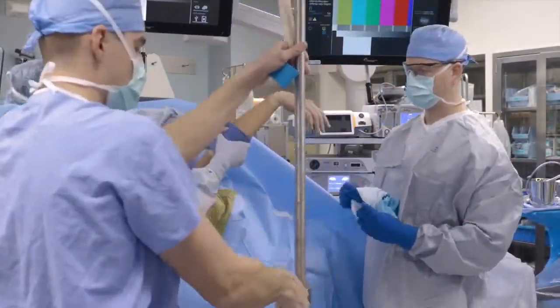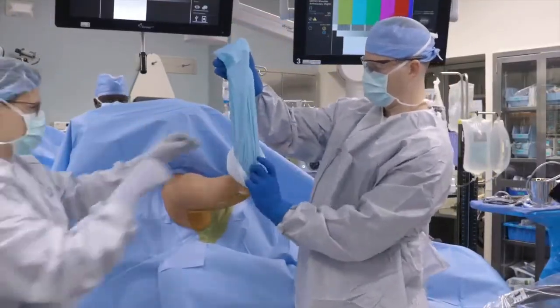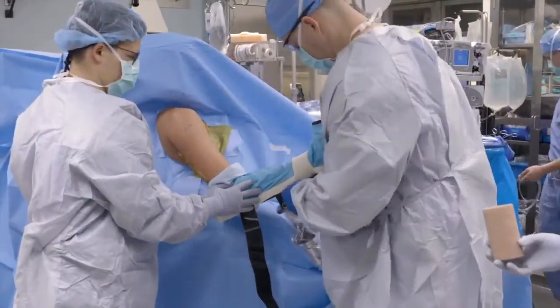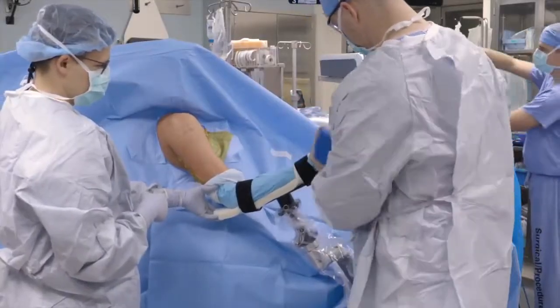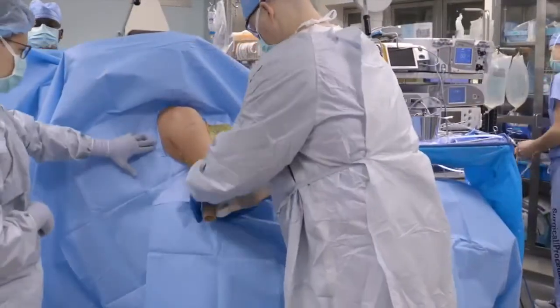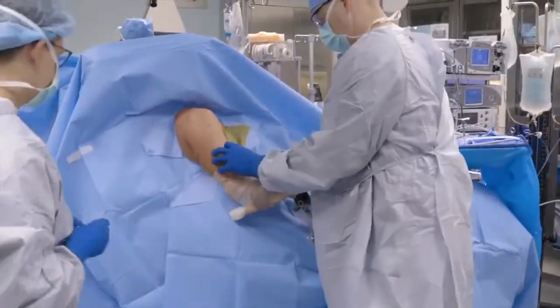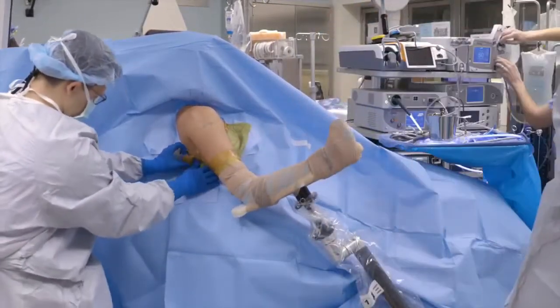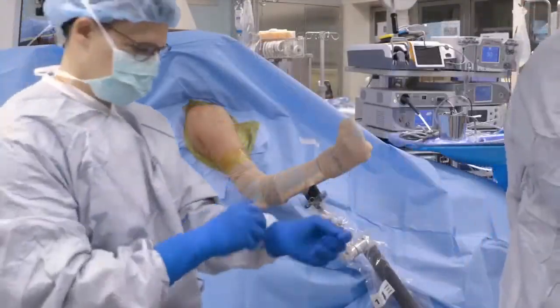The arm is then taken down after briefly being suspended, and an impervious stockinette is placed over the hand, wrist, and forearm, rolled up proximal to the elbow. It is then strapped into the mechanical arm holder securely. The arm holder is overwrapped with co-band to prevent any loosening or slippage of the arm. The co-band is taken up proximal to the stockinette so that it comes into contact with the patient's skin to prevent slippage. The borders of the drapes, stockinette, and co-band are then wrapped in IO-band to facilitate a watertight seal.